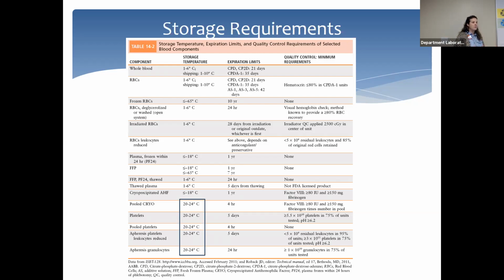If at any time your refrigerators, whether you're storing red cell units or reagents, go out of temperature, whether it goes too cold or too warm, you have to completely move everything out of that refrigerator into another location to figure out what's going on with that refrigerator, get it back in temp. And once it gets out of temperature, it has to come back into temperature. Maybe you have to add more refrigerant coolant to it or something. It has to stay within that temperature for 24 hours.